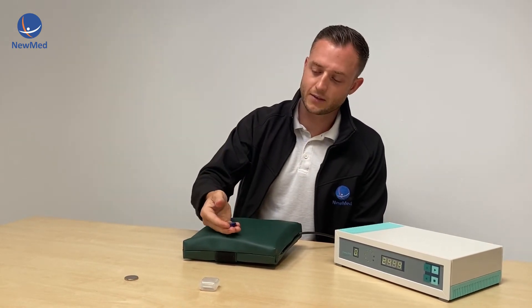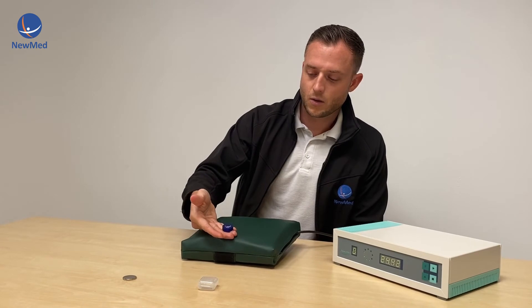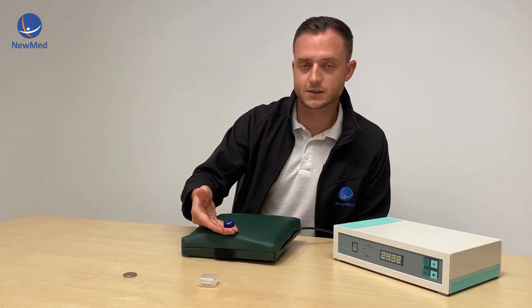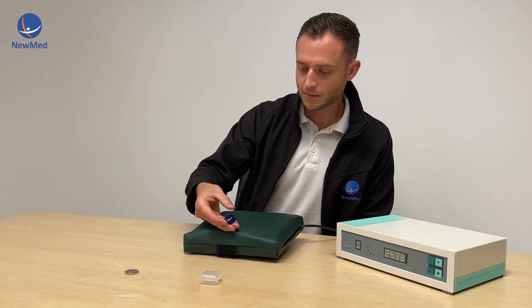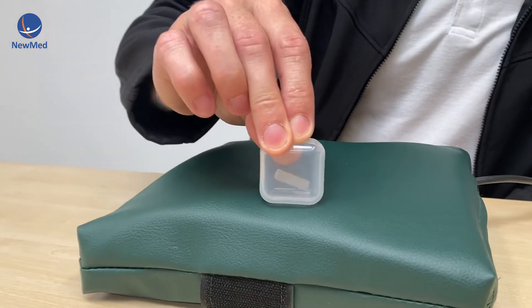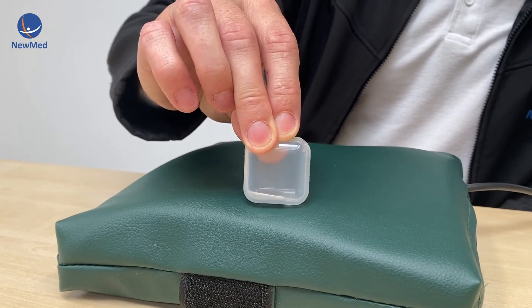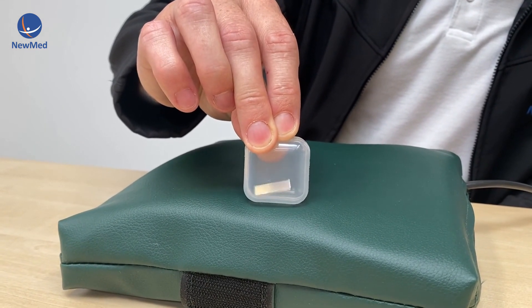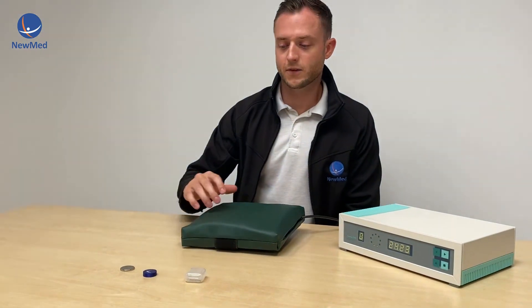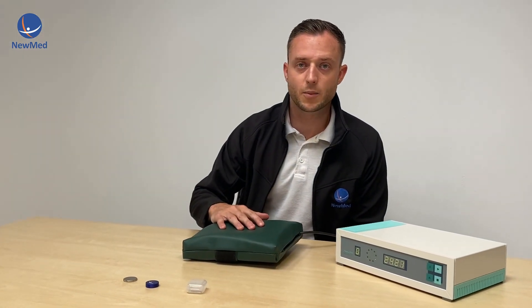This one has a magnet inside, and if we apply this to the applicator we can see it moving, and we can also see the magnet inside hitting the casing. The magnet inside is bouncing around between the magnetic fields, which is a good way to just check that our device is working and that it's working properly.